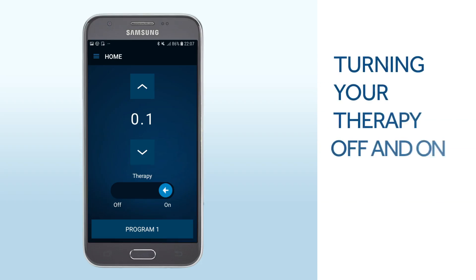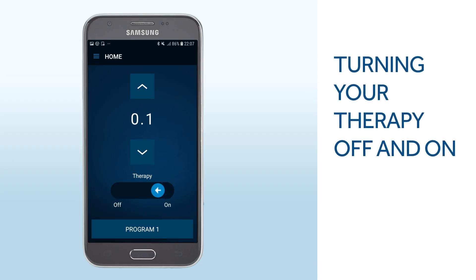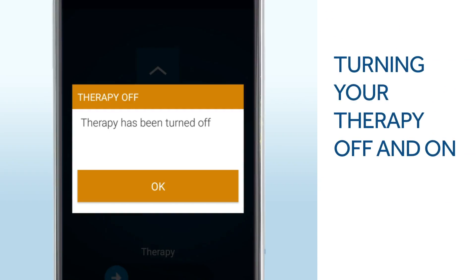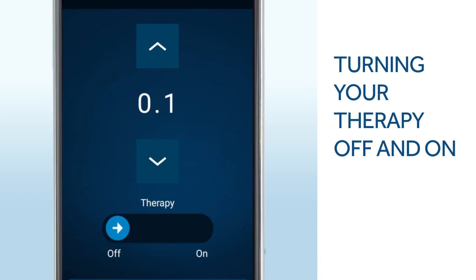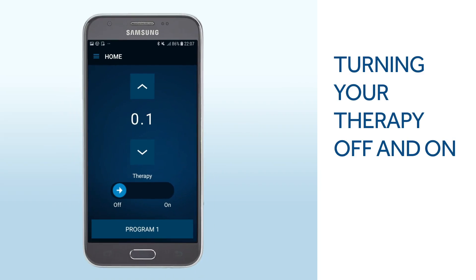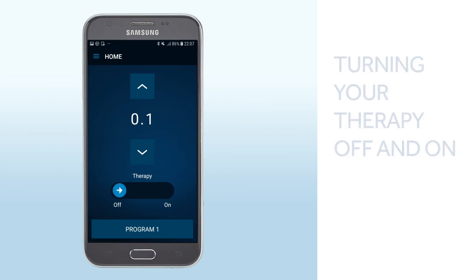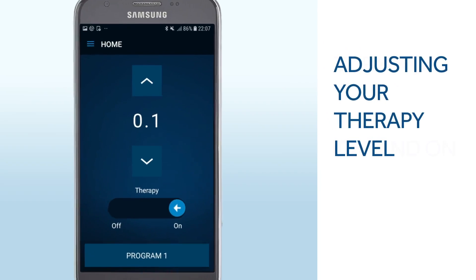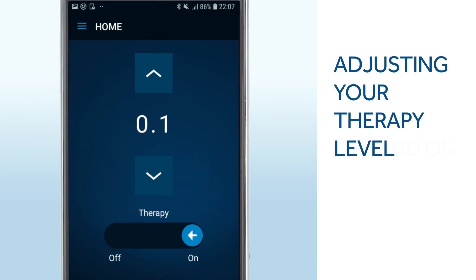To turn the therapy off, slide the arrow to the left. The therapy off notification appears. Tap OK. Your therapy remains off until you turn it back on. Slide the arrow to the right to turn therapy on. Use the up and down arrows to adjust the stimulation.